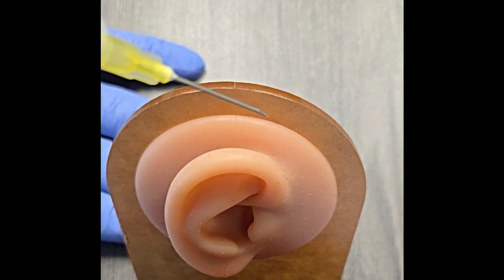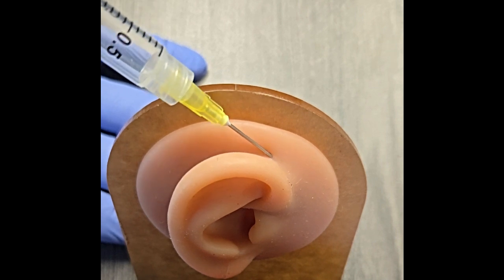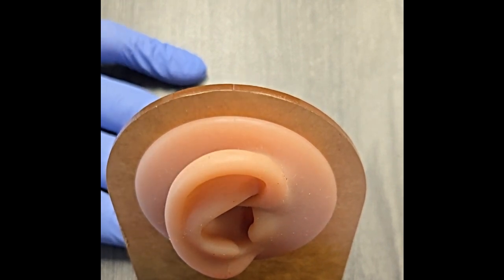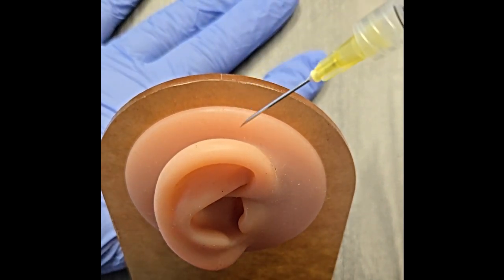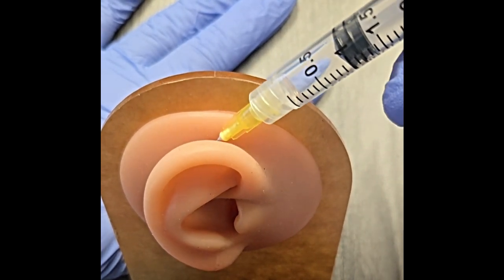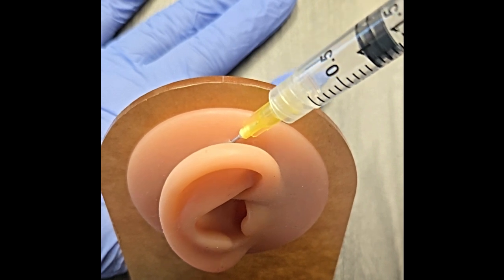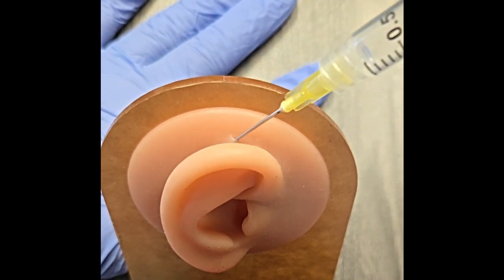It's better to show you here while we're doing the injection. So behind the ear — not into the ear or into the cartilage — as I go in I'm going to withdraw and dump all my meds in there. My lidocaine. Remember we're using lidocaine without epi because the ear is cartilaginous and has very little vasculature, so we don't want to cause any necrosis. Lido without epi, usually about half a cc to one cc per side, using a 27 gauge needle, and I inject my meds as I withdraw.